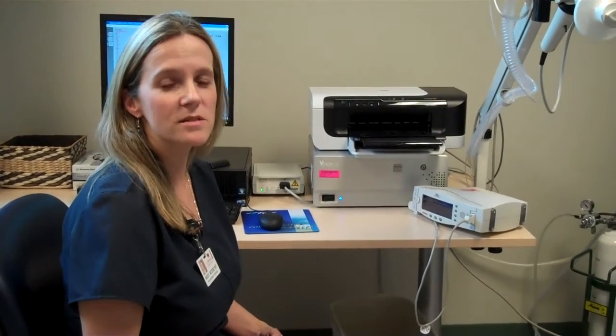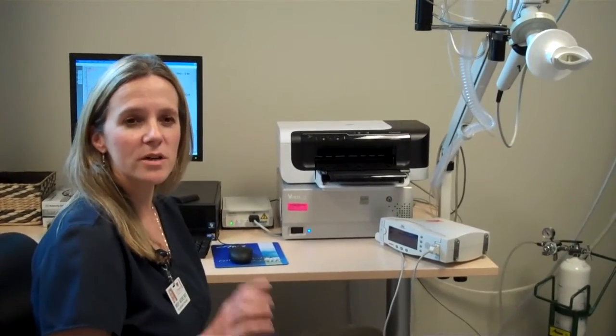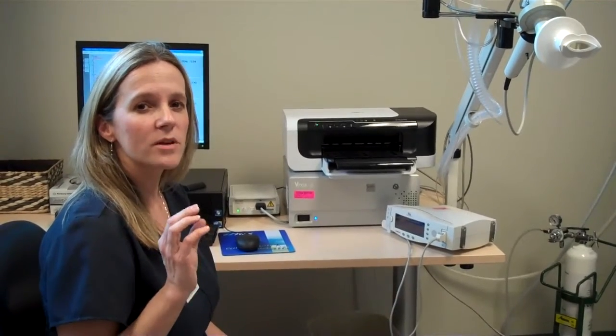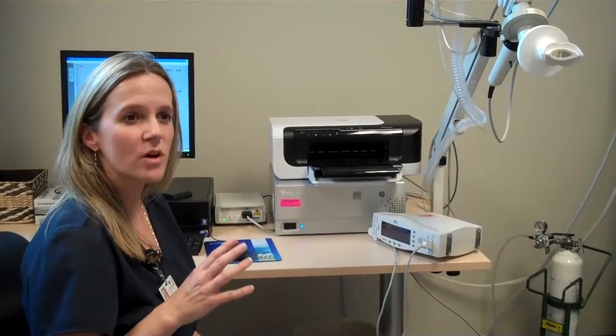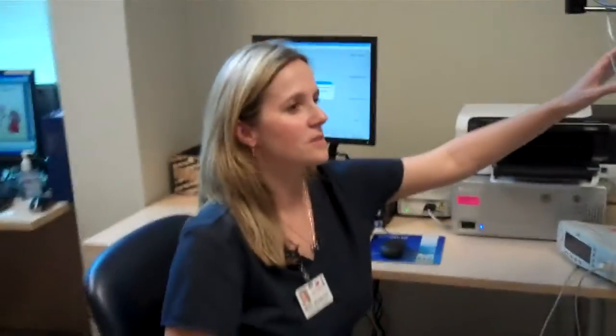The IOS is a much more sensitive test and it's offered here at the St. Tammany Parish Hospital Outpatient Pavilion. The test takes about 20 to 30 seconds and you'll do a minimum of at least three trials. I'd like to show you here with our young patient how easy this test is.